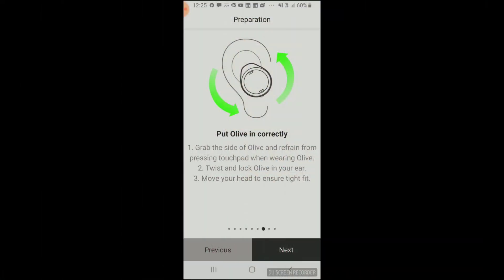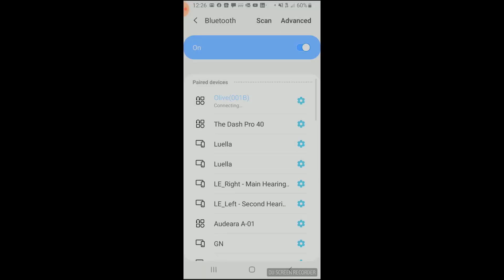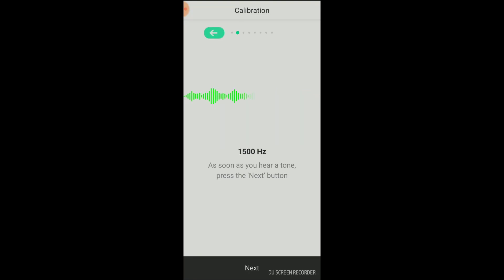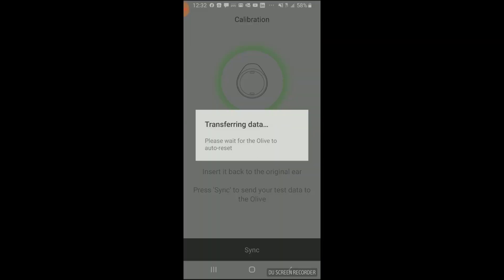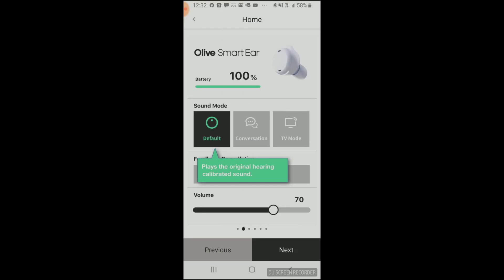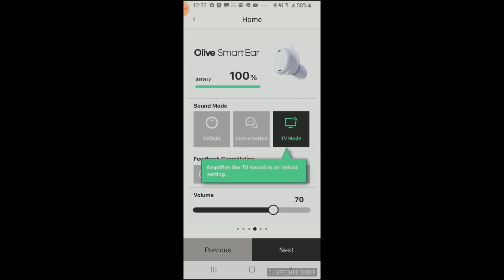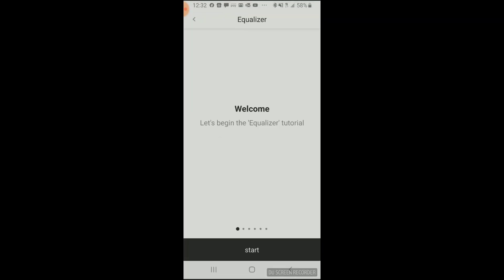After getting your Olive device in your ear and pairing it via Bluetooth on your phone, you continue setup by finding a quiet place, because it takes you through a calibration procedure — kind of like a hearing test where you listen for beeps between 500 hertz and 8,000 hertz. Once you complete this calibration, which takes only a few minutes, it gives you a brief explanation of the different programs, feedback cancellation, and volume adjustment on the home screen. There's also another tab at the bottom of the app to adjust an eight-band equalizer.